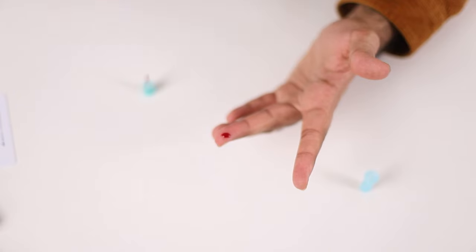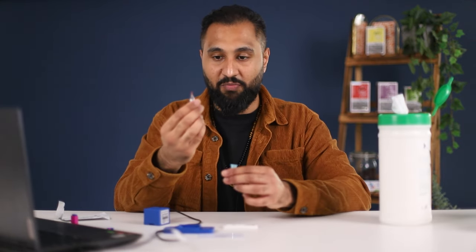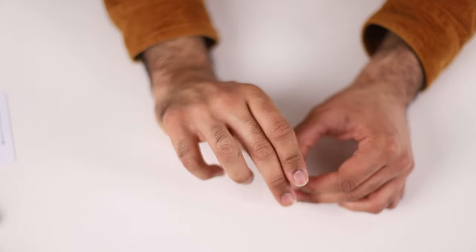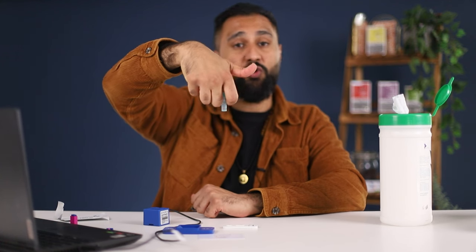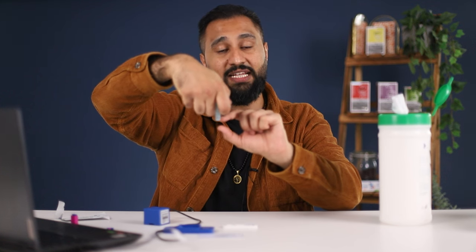Get the tissue, wrap it around the client's finger and ask them to hold their hand like this. Now that we've got the blood sample, we mix the blood with the buffer by putting the capillary in, making sure we don't touch the sides. We then close it, put it between your two fingers, and create centrifugal force — this pulls the blood from the capillary into the buffer solution and mixes it. We hold it like this and flick.